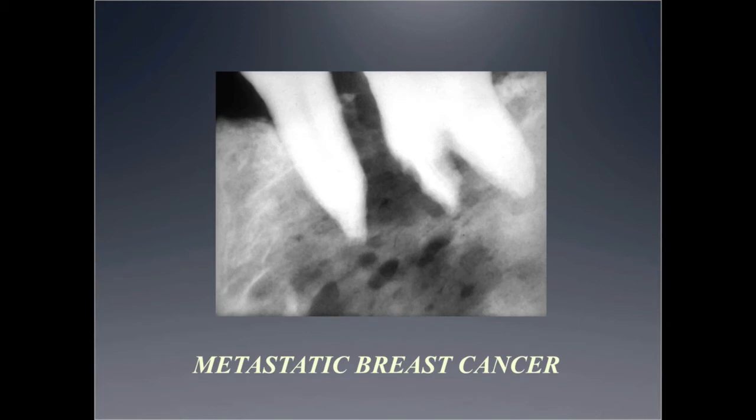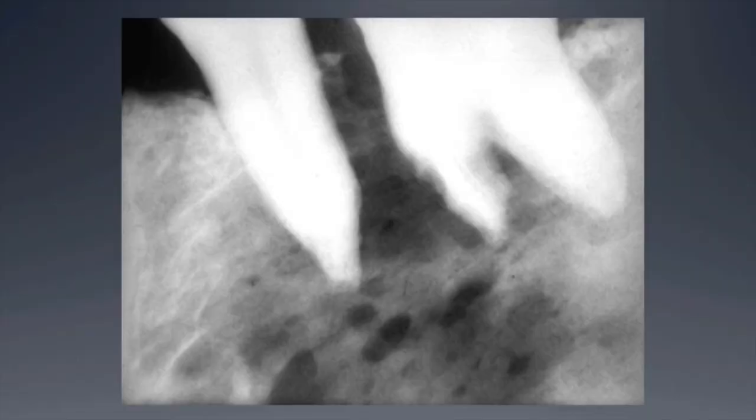Now, this doesn't quite look like periapical disease, does it? No, it doesn't look good at all. Yet, unless you know that it exists, you can't really recognize it. Here, the tip-off radiographically is the moth-eaten appearance. You see bone that looks like a fabric that has been torn apart, eaten by moths, and that's the hallmark of two things. One is malignancy, and the other is osteomyelitis.